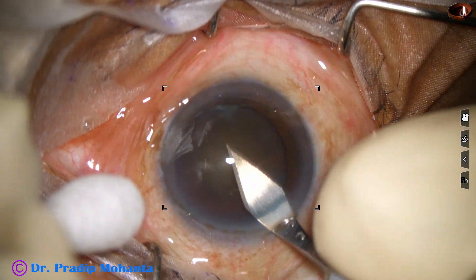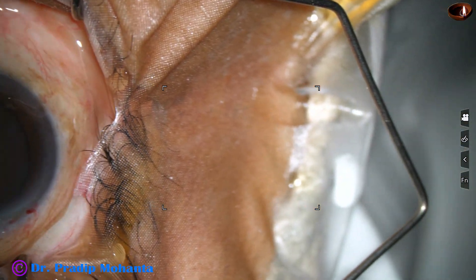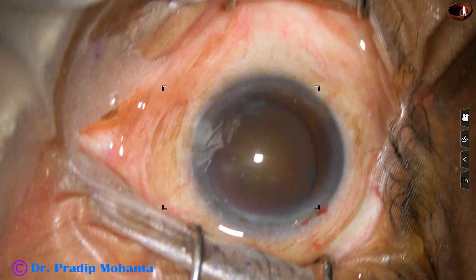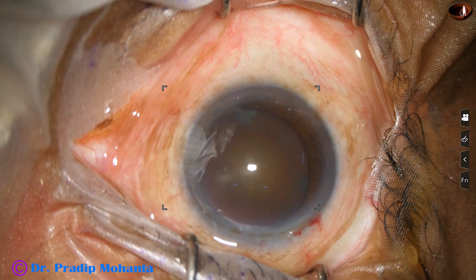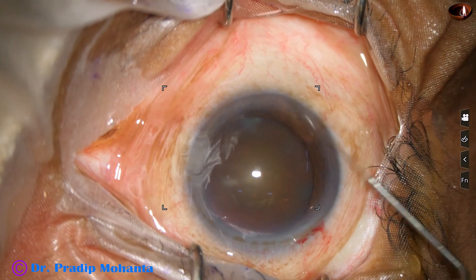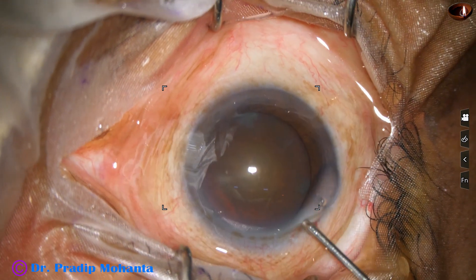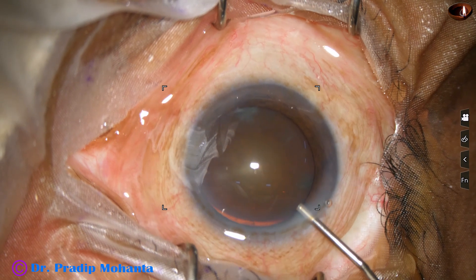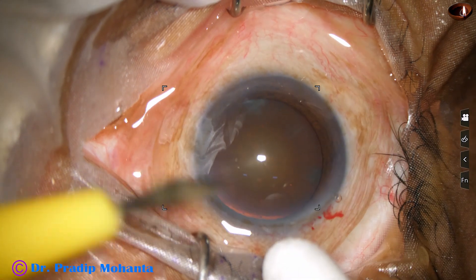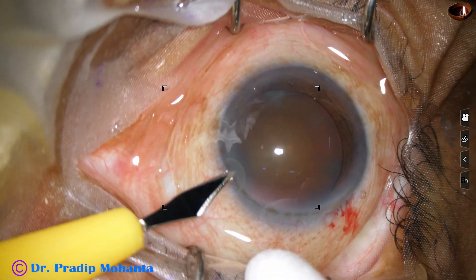This is the main incision with a 2.8 millimeter steel keratome at mid-limbus or posterior aspect of the limbus. We can see that the cataract is hard — nuclear sclerosis is grade 4 or grade 5. This is a bit of phenocaine; the patient is under topical anesthesia. This is visco filling up the anterior chamber — visco means 2% hydroxypropyl methylcellulose. And this is the side port on the left side of the main incision.